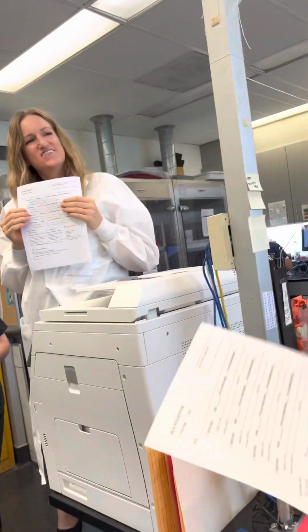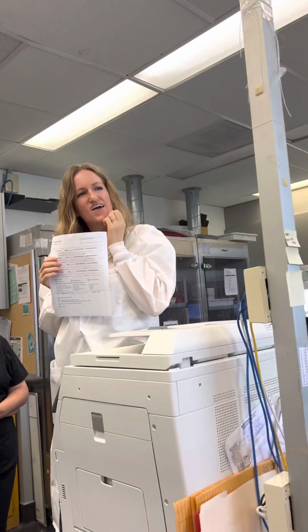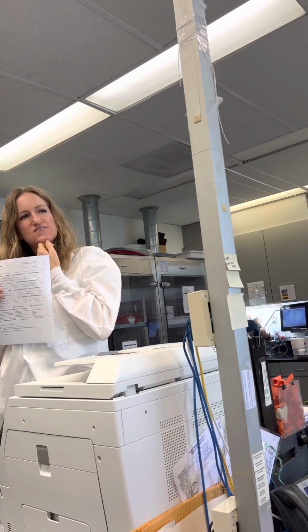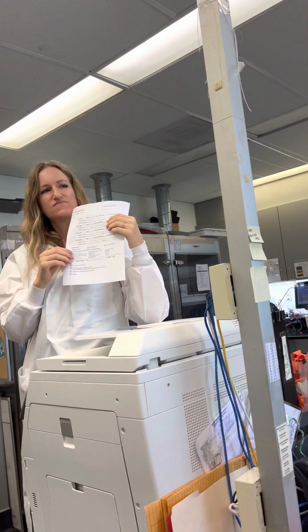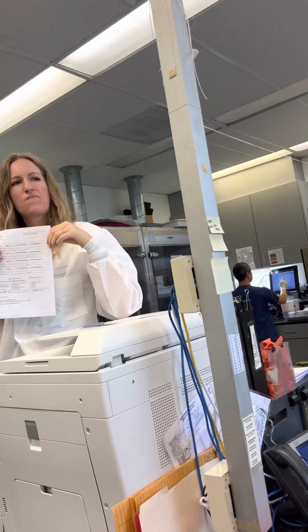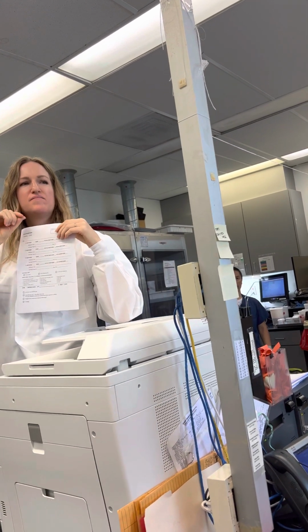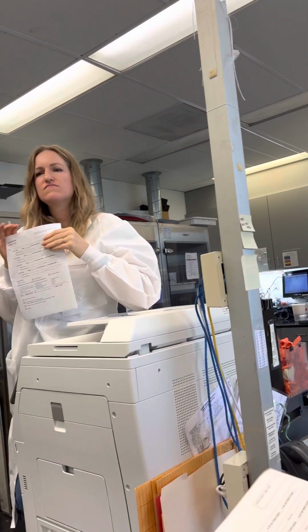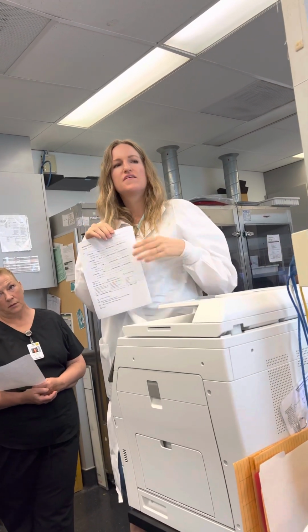And then the way it actually goes, we'll take the needle, wire out the first sample for the slides, the rapid read slides, and then the rest of that sample that's in the needle, we splat it into formalin. Yep. And then we're going to put all the passes into the formalin though. There might be 3 more passes in that one site. But pass 1 is slides, and everything else is formalin. You'll just put passes 2, 3, and 4 in the same formalin. Okay, that's okay. Does that sound reasonable? Yep, that's how it's done.